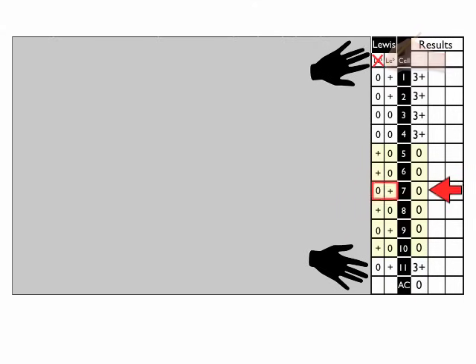Moving on to cell 7, again, you can see the same sort of thing. A double dose Lewis B, put a single slash, move on down to cell 9 where you have another one and put another slash. Again, that's the way that I typically do it. However, if I'm rushed or if I'm on an exam, and again, the way many people do it is they'll look at it like this.